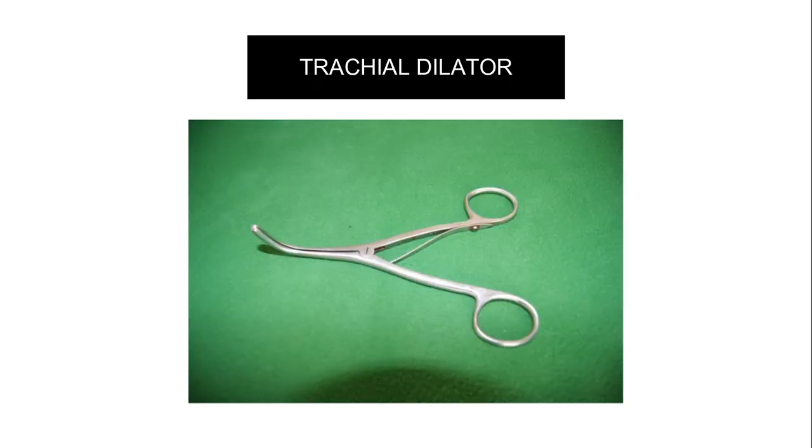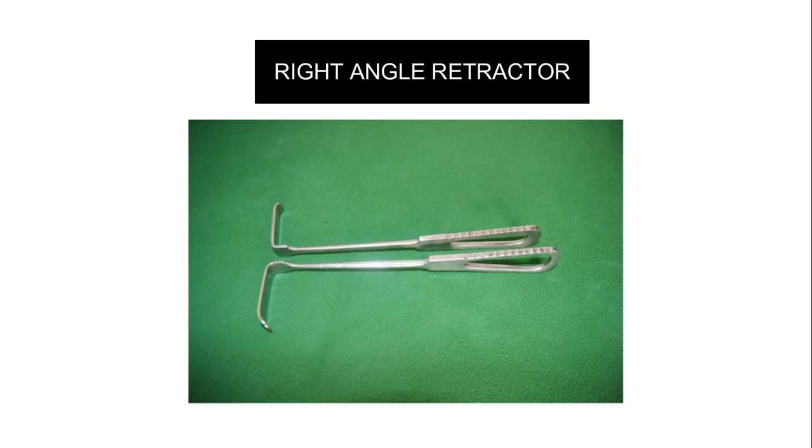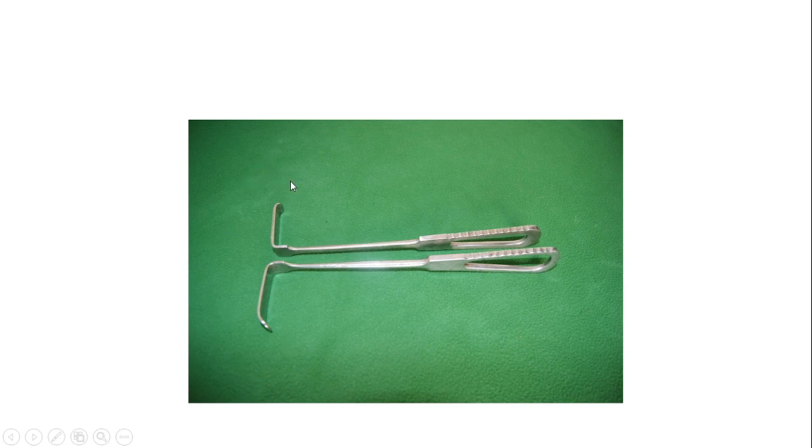This is the tracheal dilator. When you squeeze the handles together, the tips open outward. In tracheostomy, after making the incision, this instrument is used to dilate the tracheal opening. This is a very important instrument. This is the right-angle retractor — a soft tissue retractor.